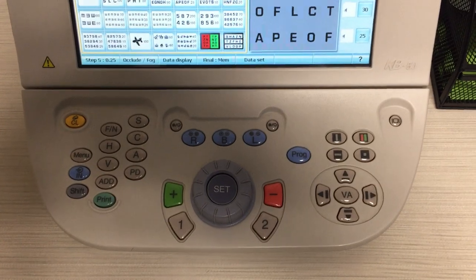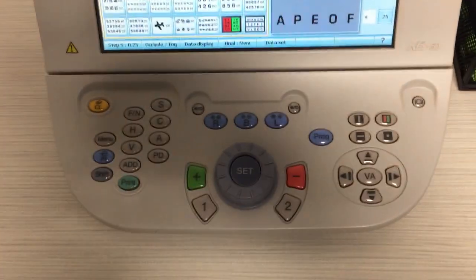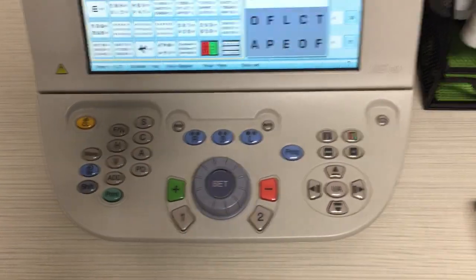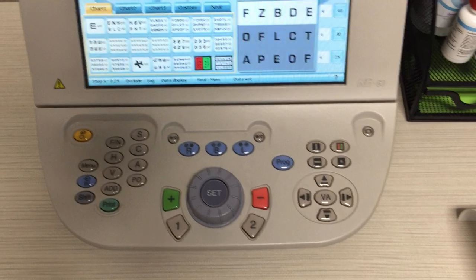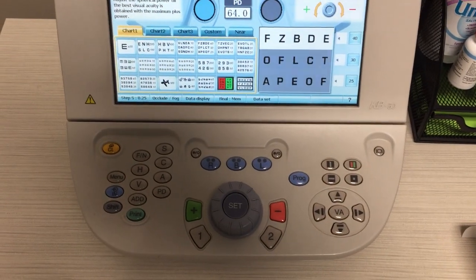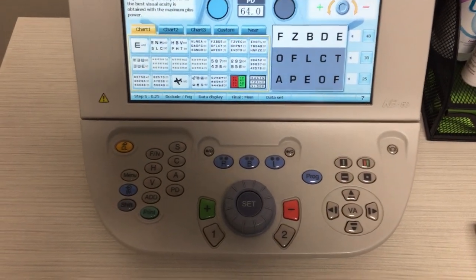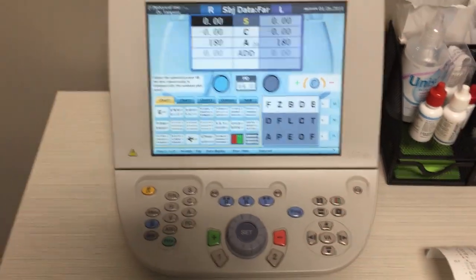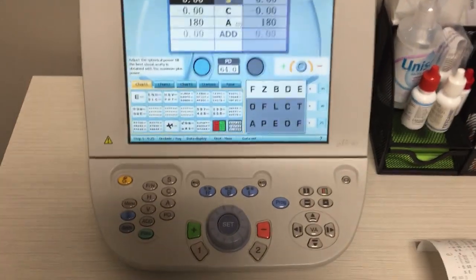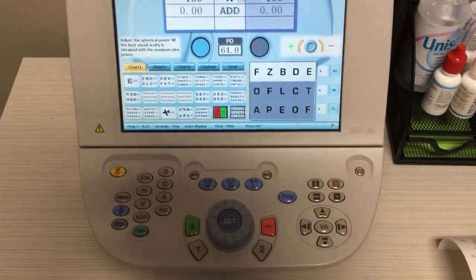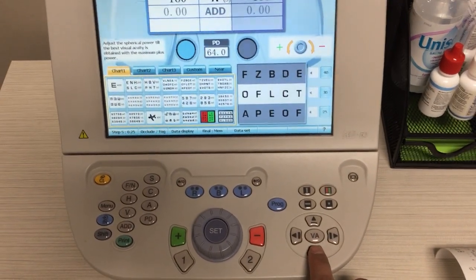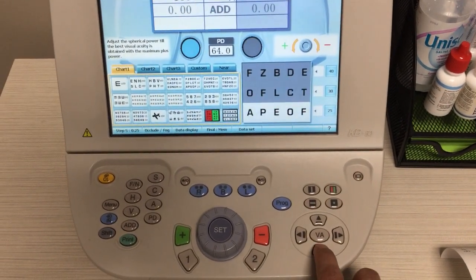On the bottom of this control unit the most important thing is this dial right here. That dial is used to toggle between numbers going up plus in power, minus in power, changing the cylinder, and changing the axis. On the lower right you can change the letter size with these arrows here going up and down.